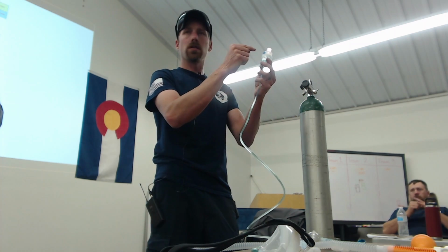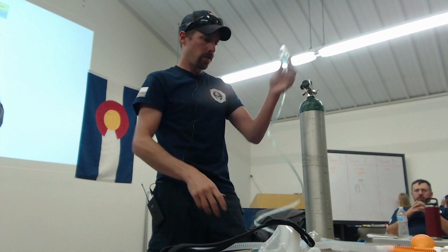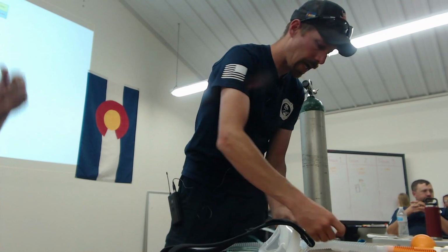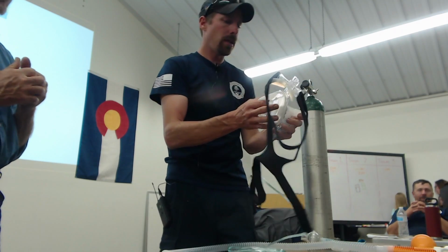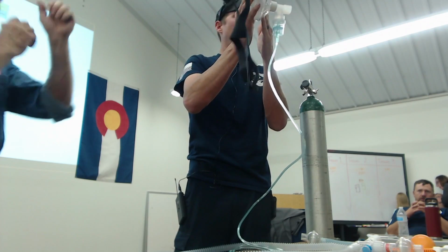But in this, you can still take a syringe, and the tip of the syringe can poke into there the same way, and you can add your 2 milliliters in there. So you can do that while the whole system is under pressure. So to add this into the system, you need the nebulizer to be close to the patient.